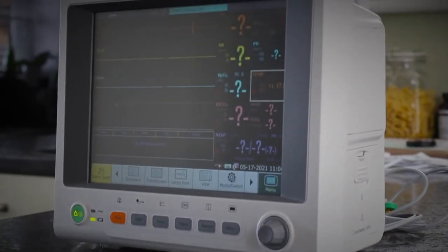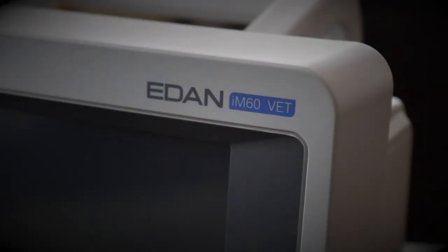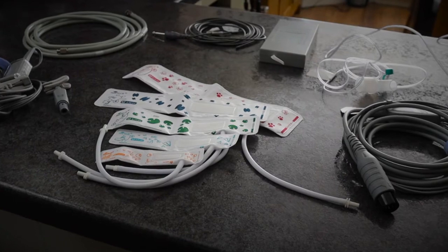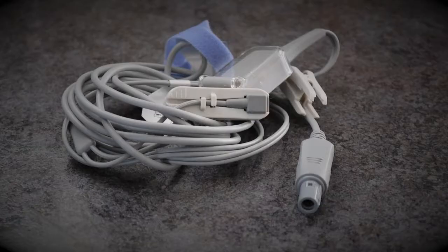This is the EDAN IM60 multi-parameter machine available from VET Direct. These are the components needed to set up the machine.